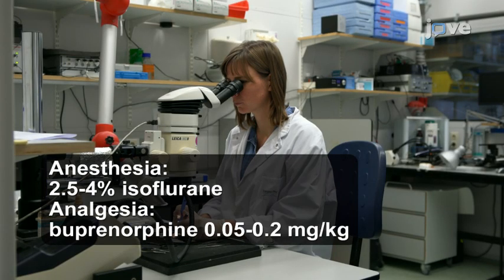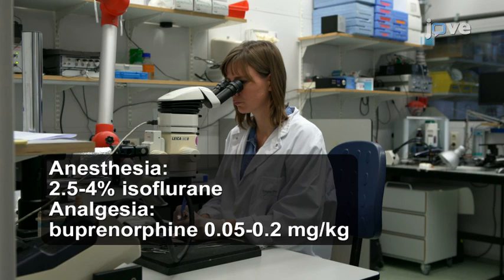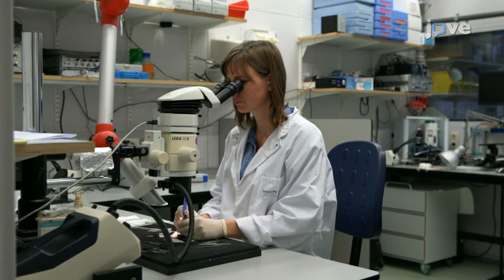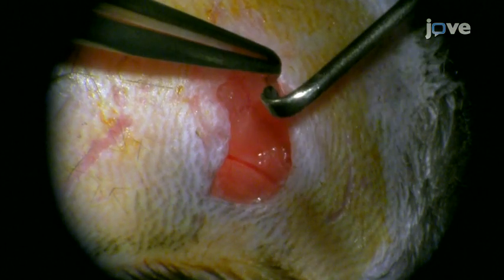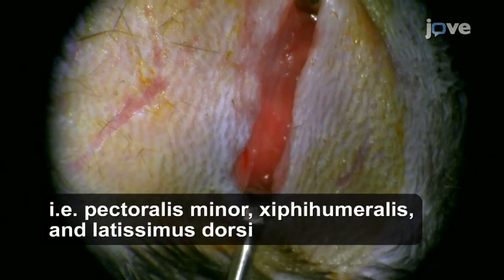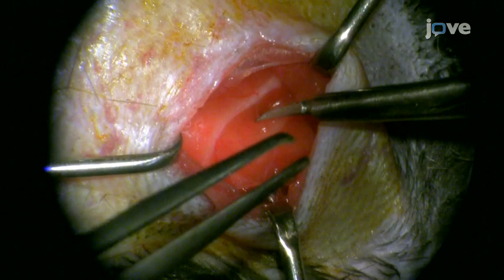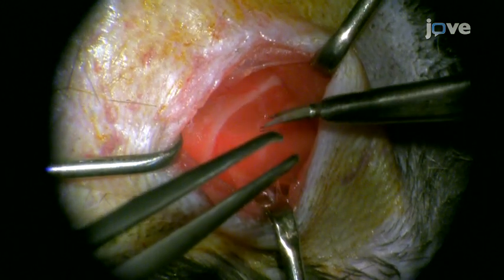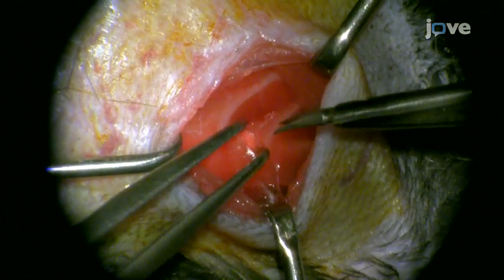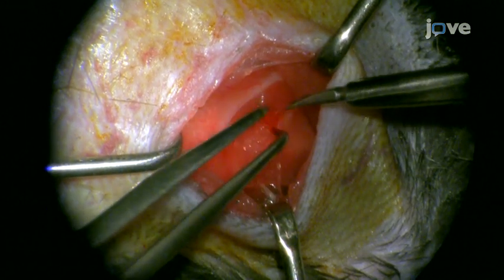Begin by making a small incision in the skin of a 12-week-old mouse between the second and third ribs. Then using small hooks, pull aside the chest muscles to expose the intercostal muscles. Next, use curved 2 mm blade spring scissors to carefully cut through the third intercostal muscle without damaging the lungs.